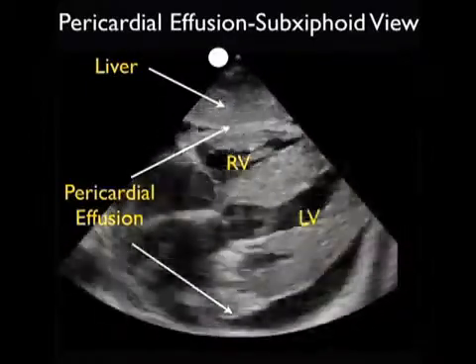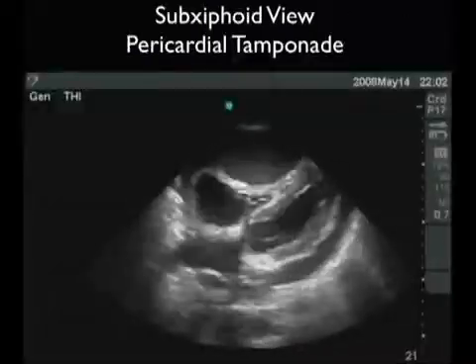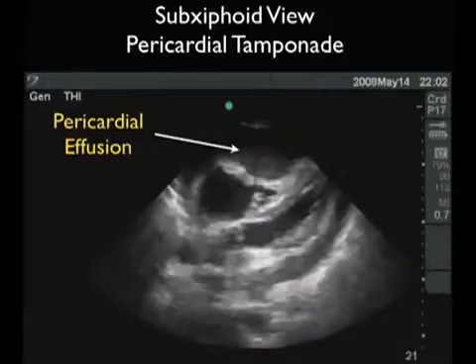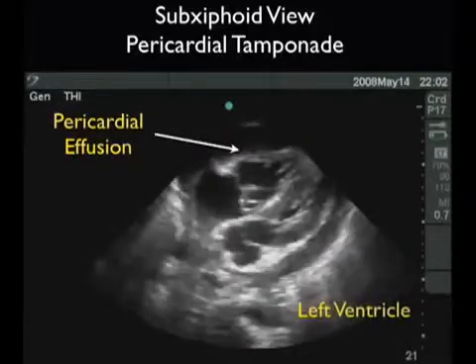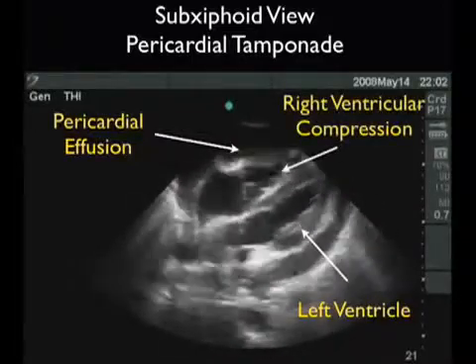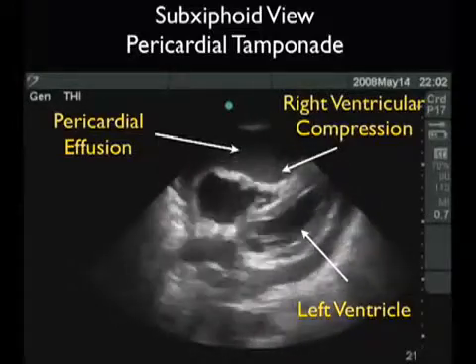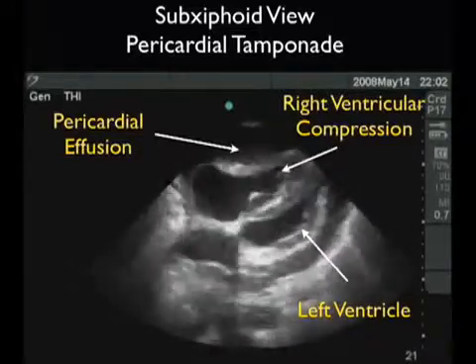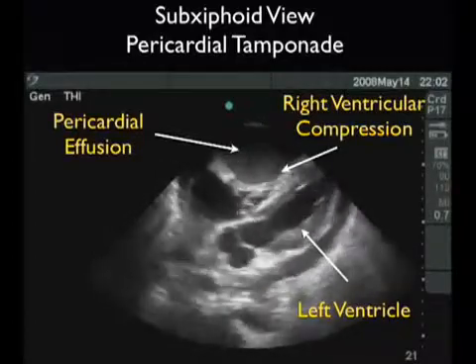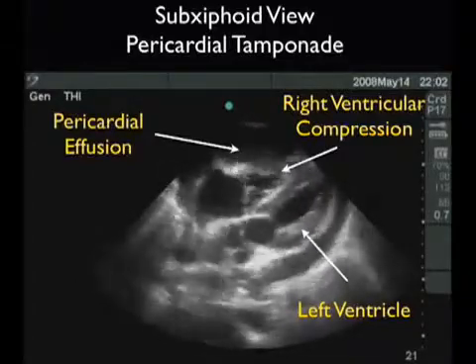If we see a large pericardial effusion on bedside echo, our next move is to look for signs of cardiac tamponade. Here's a patient who manifests all the signs of cardiac tamponade on bedside echo. Notice the very large pericardial effusion and the chaotic movement of the right ventricle as it struggles to open during diastole. The compression of the right ventricle in this patient is consistent with advanced cardiac tamponade. The right side of the heart is preferentially compressed before the left ventricle due to its lower pressure circuit.